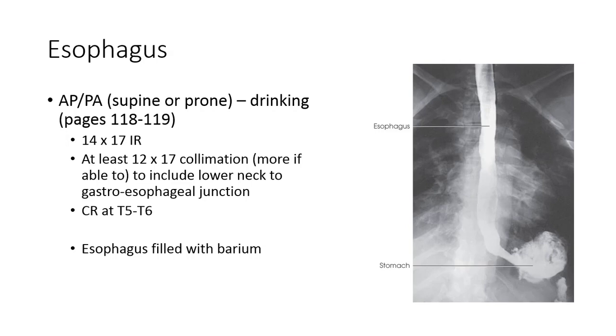For this exam, preliminary patient prep is not mandatory. Exams can be single or double contrast. For single exams, either barium or water-soluble iodinated contrast may be used. The first part of the exam performed with the radiologist is a functional study of the patient's swallowing.